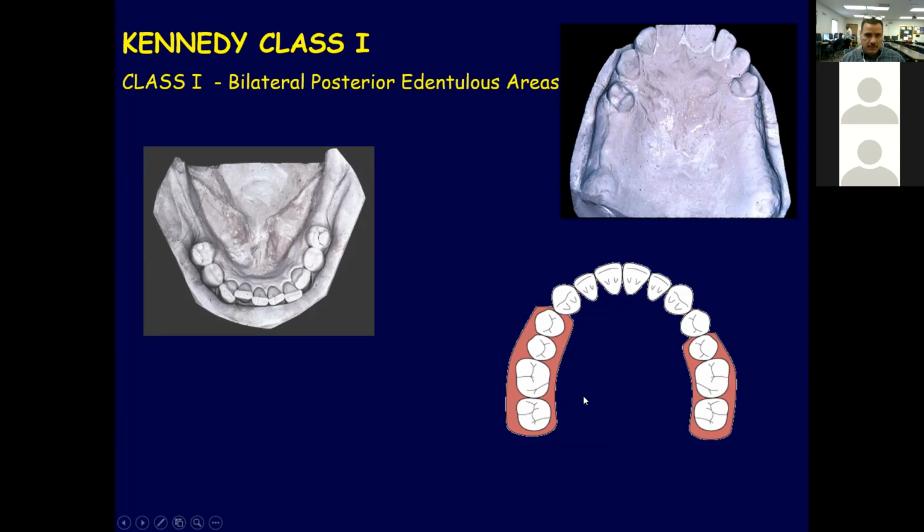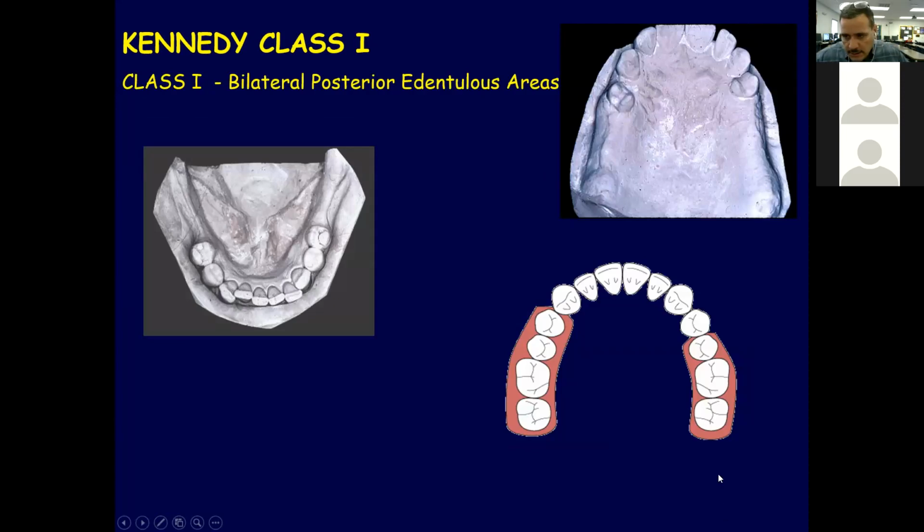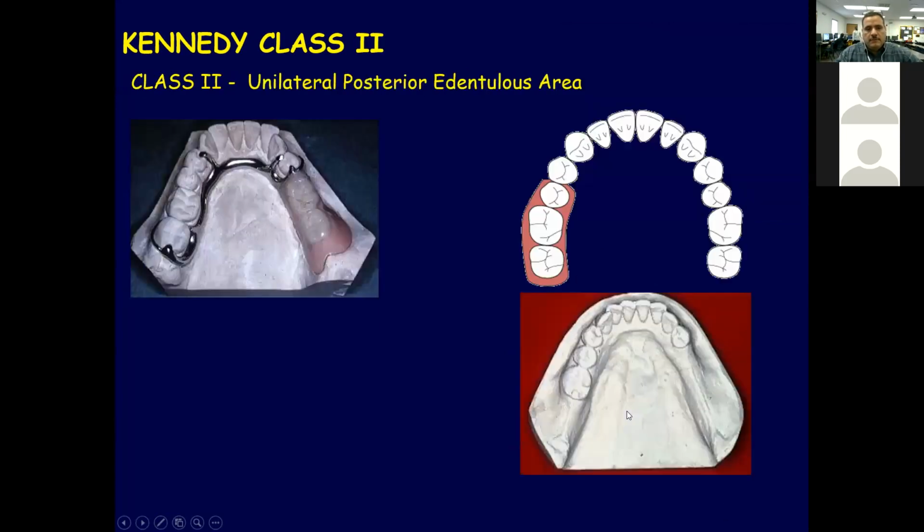We have limited space, so we rarely put in the wisdom teeth unless the patient is young and has a big space and there's a gap. You can put a third molar, but in general, we replace the first molar and second molar. It depends on how much space we have. So for this one, this is the first molar. When you replace the second premolar, sorry, and one molar, maybe it's enough because there's no space. It will be one here and one here. So in general, we don't replace the second molar. Okay, that's for class 2.